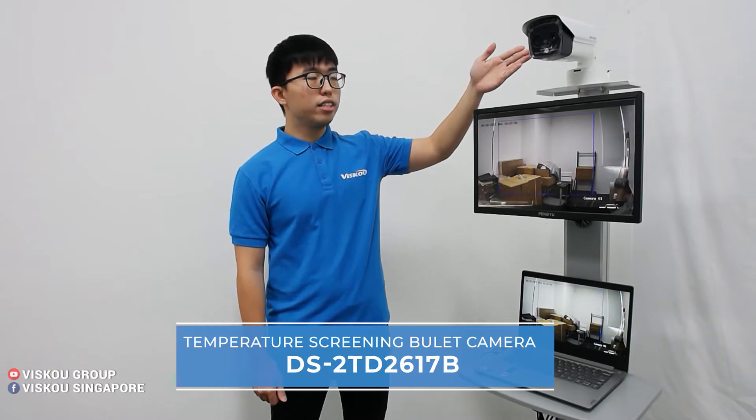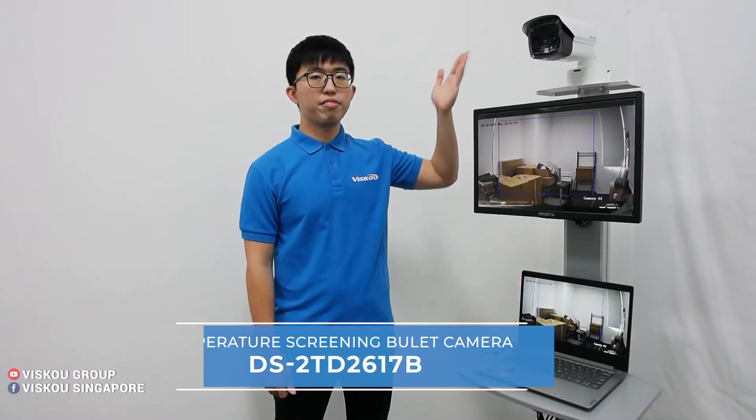This temperature screening bullet camera has temperature measurement accuracy up to plus or minus 0.5 degrees Celsius.